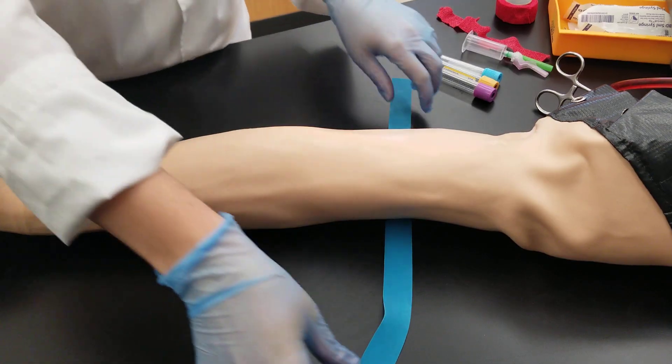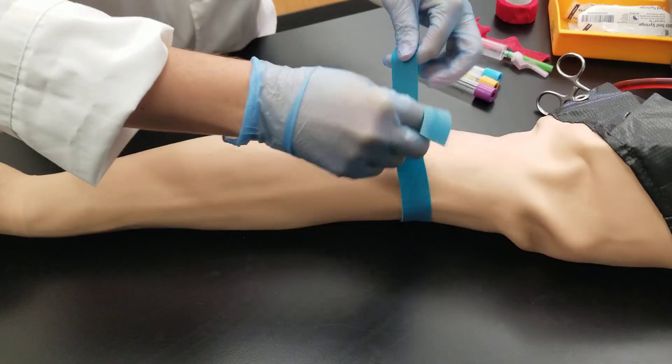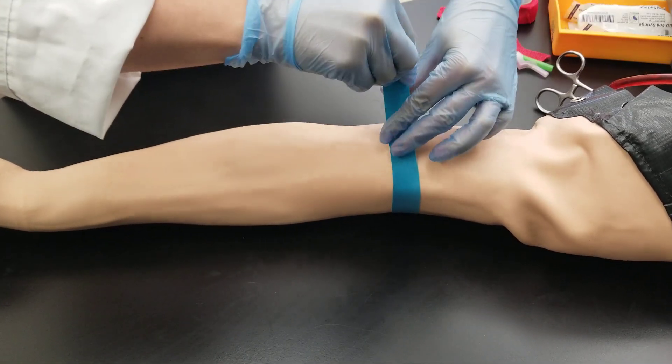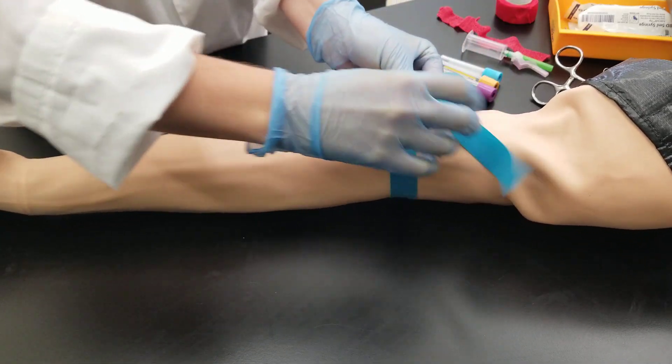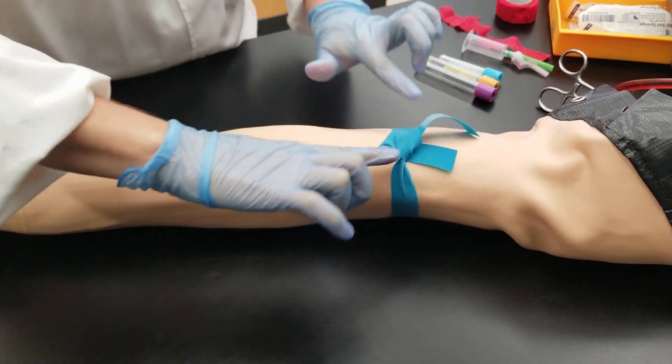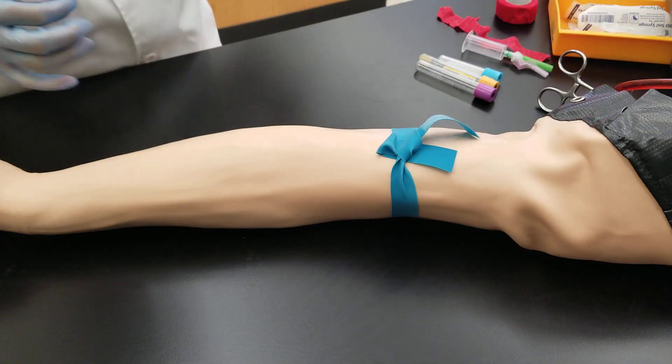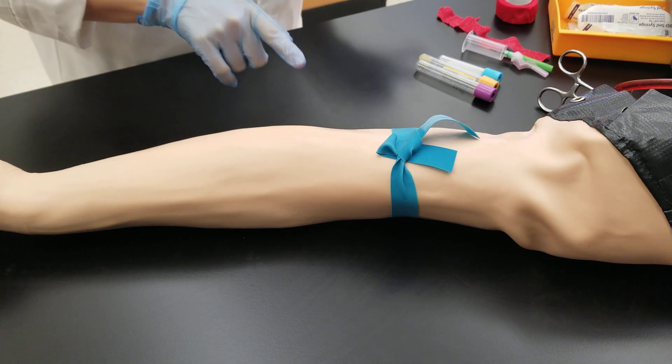And now I'm going to reapply the tourniquet. So we are above the draw site, which is three to four inches above the draw site. We're keeping our tails of the tourniquet up towards the patient's arm. We already cleansed the area.